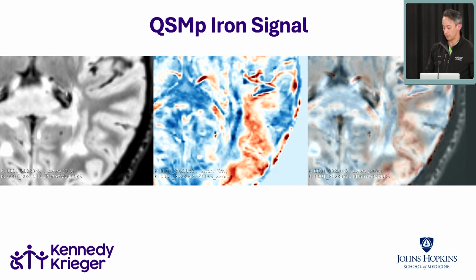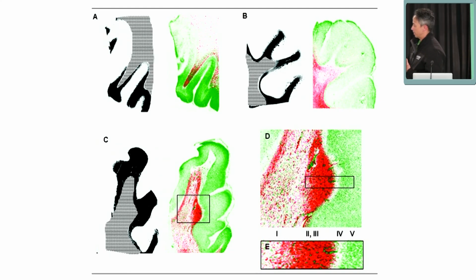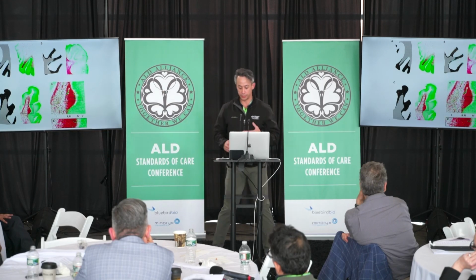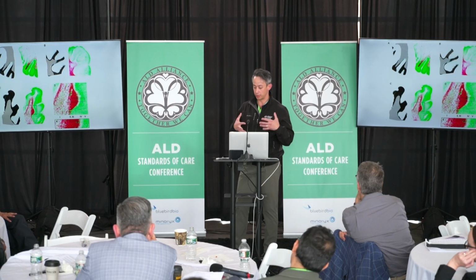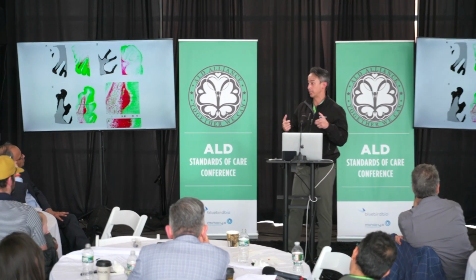And you always want to take an opportunity to try to one up your mentor. So, we've seen this before, right? My hypothesis here is, and this is Dr. Eichler's work that he alluded to earlier, thinking about microglia and what they're doing in and around a lesion in the cerebral ALD brain. And he points out that this region number 4 here is where it's thought that microglia are dying, and there's this band around every lesion where there's no microglia.